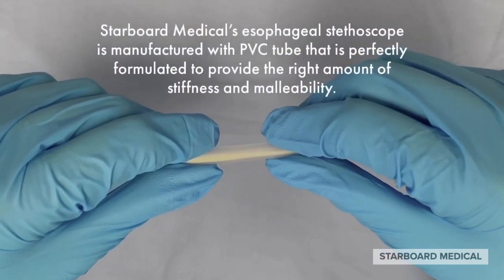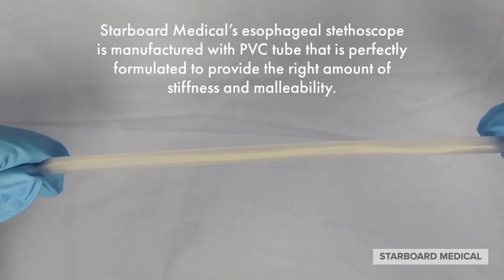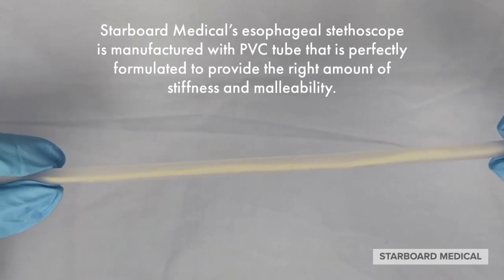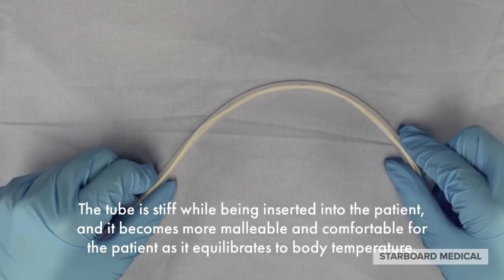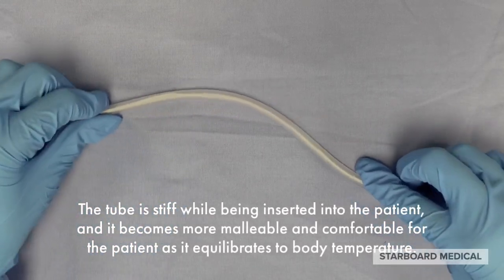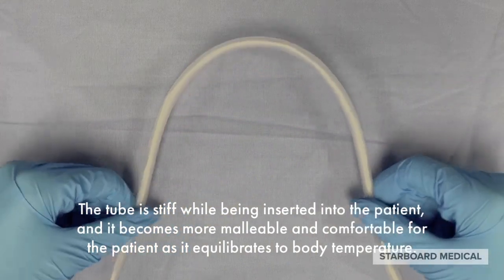Starboard Medical's esophageal stethoscope is manufactured with PVC tube that is perfectly formulated to provide the right amount of stiffness and malleability. The tube is stiff while being inserted into the patient and it becomes more malleable and comfortable for the patient as it equilibrates to body temperature.